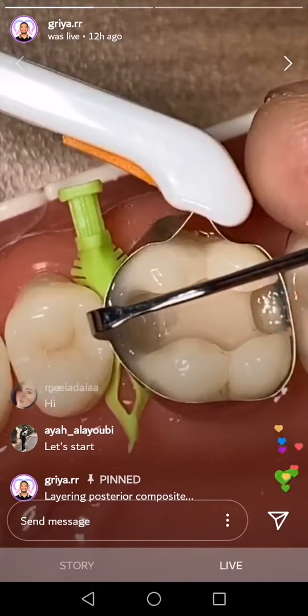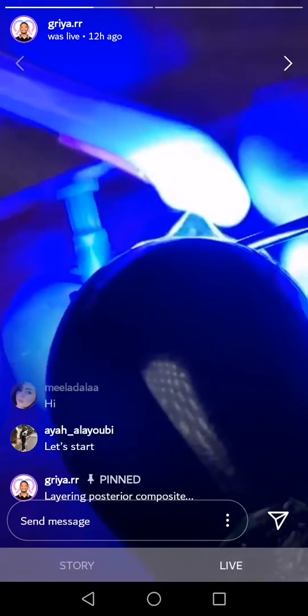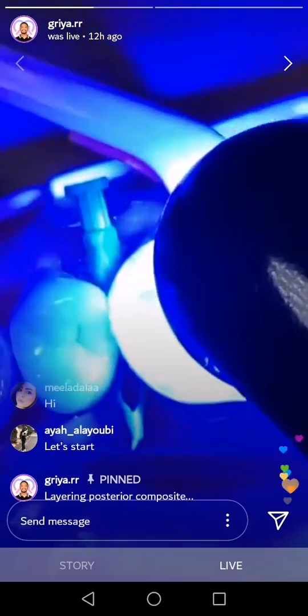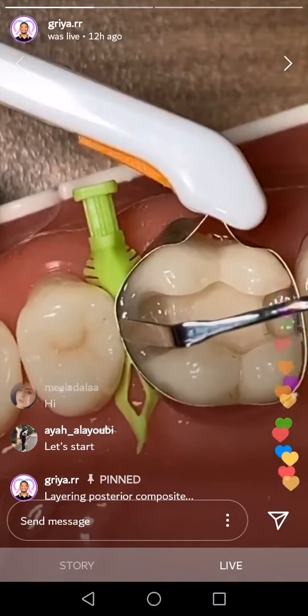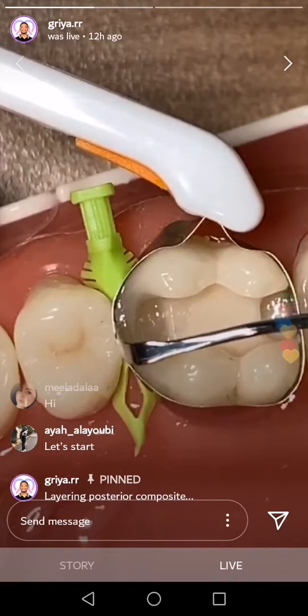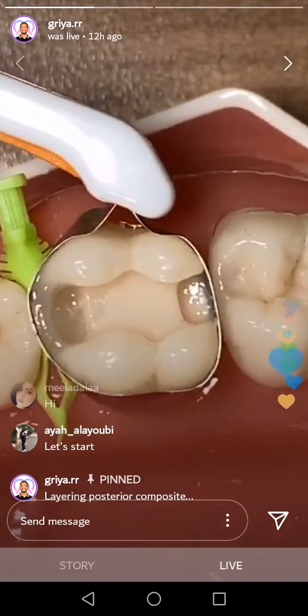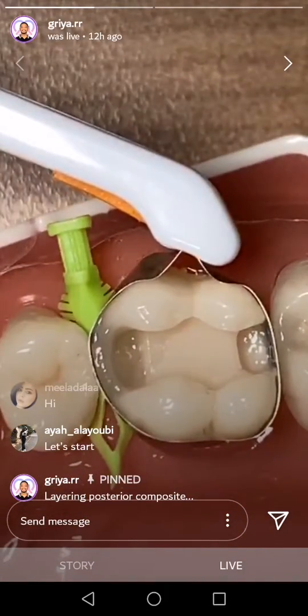Yeah. Okay. To make sure, I'm doing like this. Push like this. Okay, and then now let's do in this side.